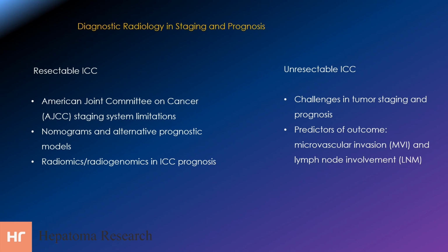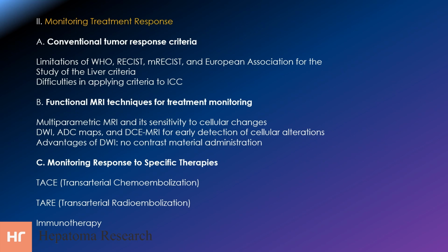Next part of our article is explaining the role of diagnostic radiology in monitoring the treatment. Conventional tumor response criteria such as WHO, RECIST, mRECIST, and European Association for the Study of Liver criteria rely on changes in tumor size or enhancement to assess response, but they have limitations in reliability and reproducibility. The hypovascular nature and fibrous stroma of ICC make it challenging to apply these criteria accurately.